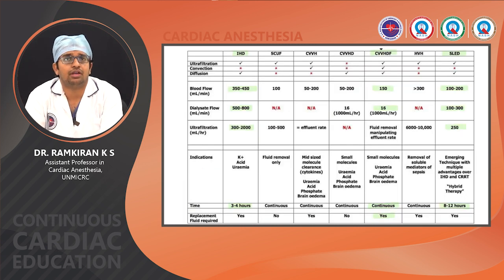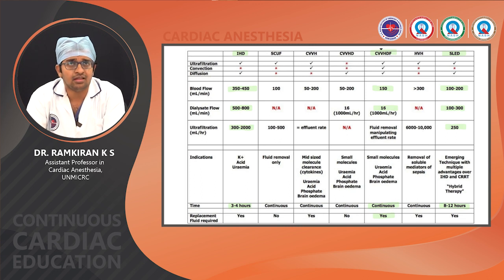Now, this is the overall set of dialysis modes which we commonly use. Here we compare the three main ones: intermittent hemodialysis, CVVHDF and SLED. If you see, the blood flows are very high in intermittent hemodialysis because it is done very quickly.